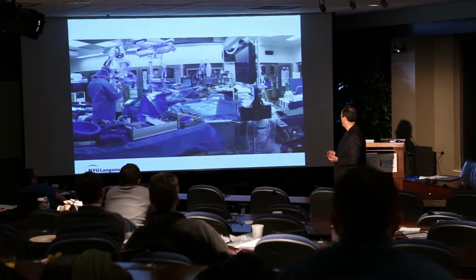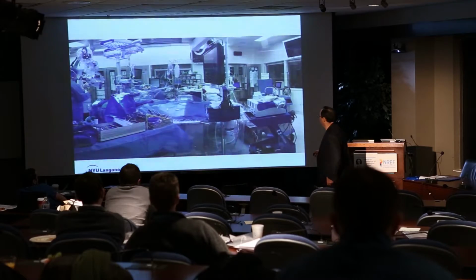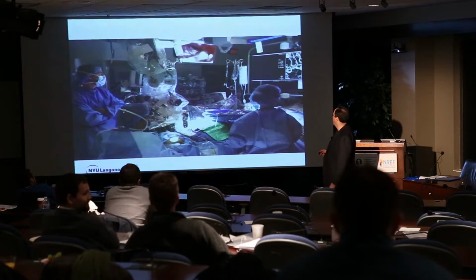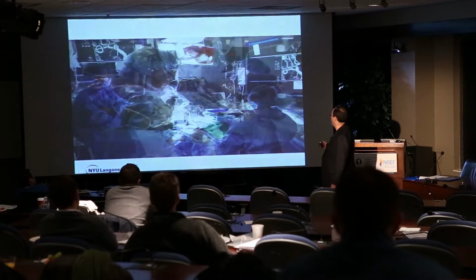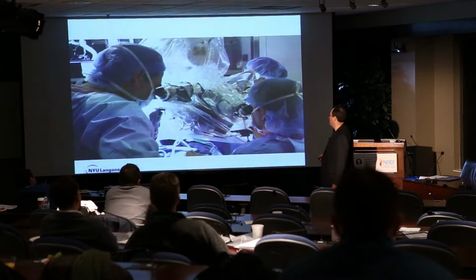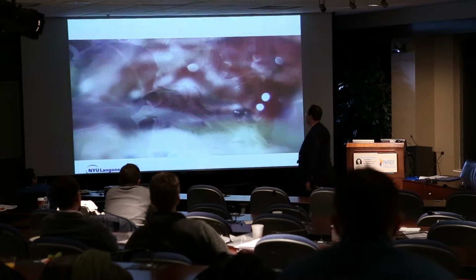So this is the room that we use here at NYU. I have an intraoperative angiogram. We bring up the preoperative images beforehand. This is my chief resident sitting down, about ready to clip the aneurysm with me.